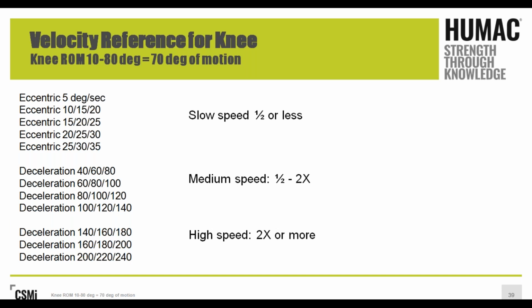The first number for us always represents the concentric speed. So knowing that, if we say eccentric loading in our protocols that we develop, then we know that the eccentric speed will be half of that number. So if we write eccentric loading 30, 40, 50, that tells us we're going to be doing 3 training programs with a specific rest period in between, typically 10 repetitions. And our first exercise is going to go 30 degrees concentrically, but what back eccentrically? Correct, 15. We're going to go 15.